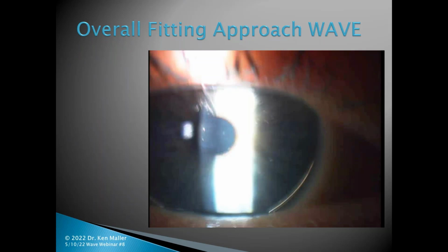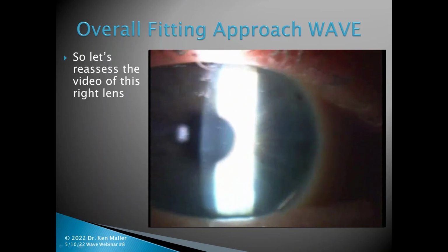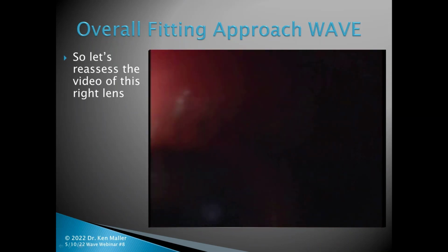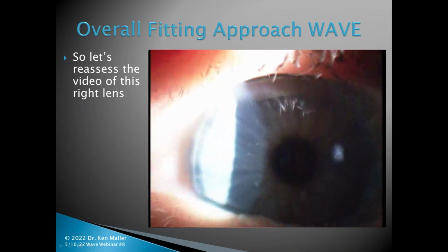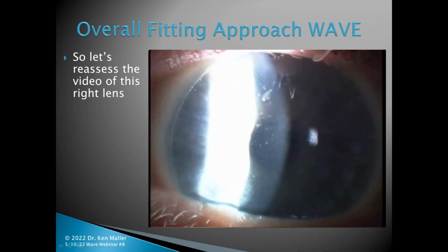So let's take a look once again at this particular video. And with that in mind, thinking about the positioning of this lens, look at how beautifully centered this lens is, and take a look at the movement on the blink.